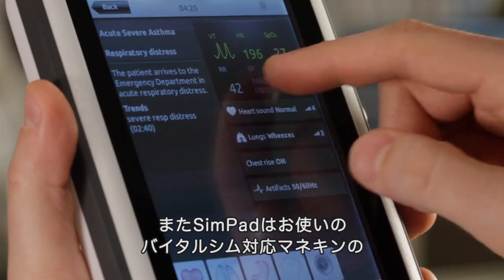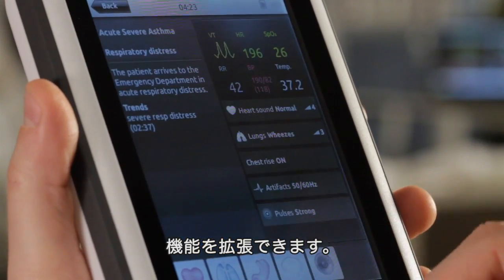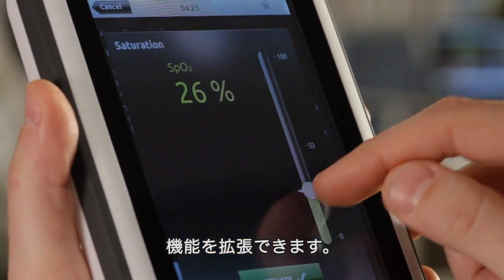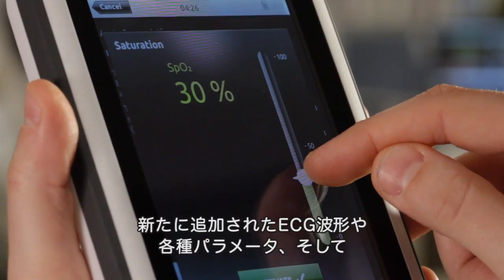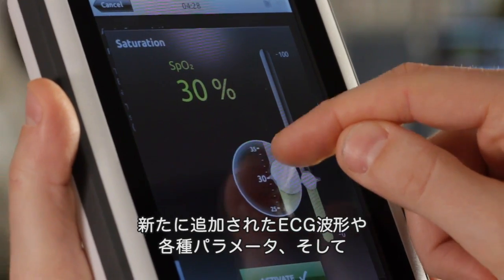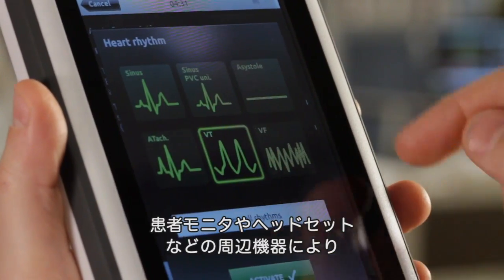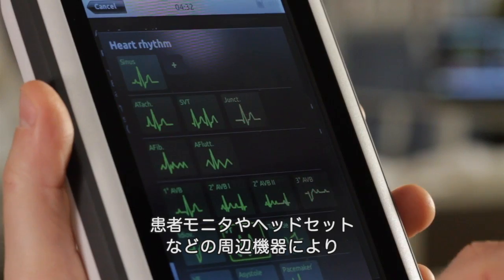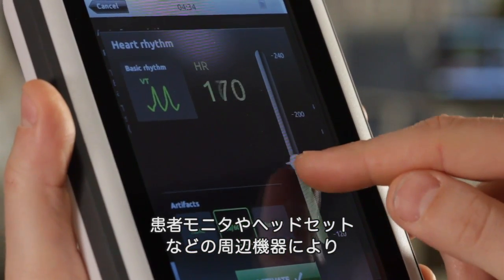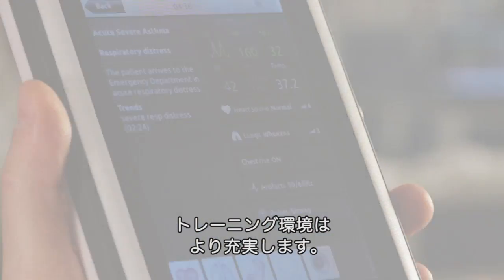SimPad can revitalize your existing vital sim equipment by offering improved features and functionality, including an expanded ECG library, new patient parameters and accessories, such as a wireless patient monitor and headset, which enhance the training environment.